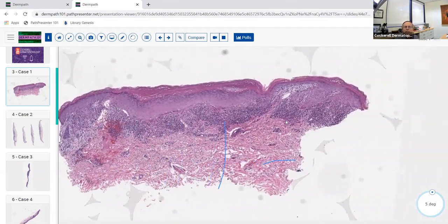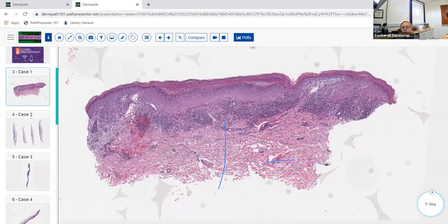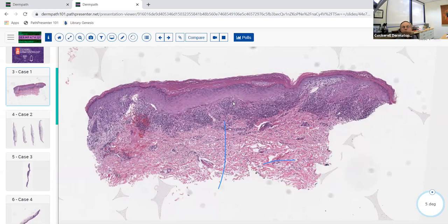One question that comes up is the distinction between lichen planus and a lichen planus-like drug eruption - these can look virtually identical. If you see eosinophils in the infiltrate, that would tend to favor a lichenoid drug eruption, but you do not have to see eosinophils in a lichenoid drug eruption. You can also get lichenoid photodermatitis - usually lichenoid drug eruptions that are photoexacerbated, such as with hydrochlorothiazide. These can look very similar to lichen planus.